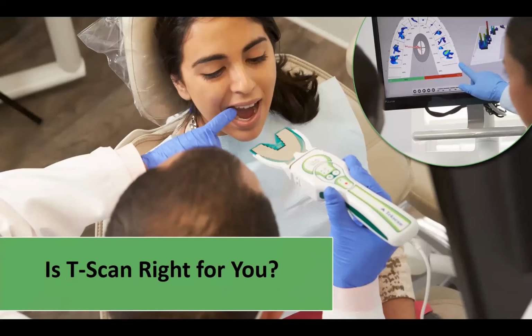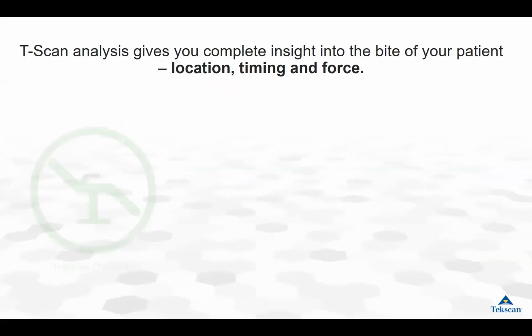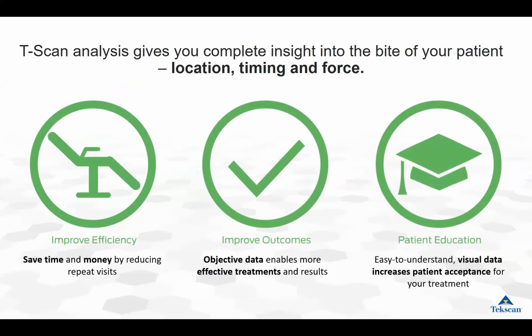So inevitably, as you're listening and watching the webinar, you may be wondering, is T-Scan a good fit for me? Is it good for my practice? Would my patients respond in this way to it? So when we began the webinar, we talked about 3 of the most common occlusal problems that you face as dentists. And we hope throughout this webinar, we've been able to show you how the use of T-Scan helps address those problems.